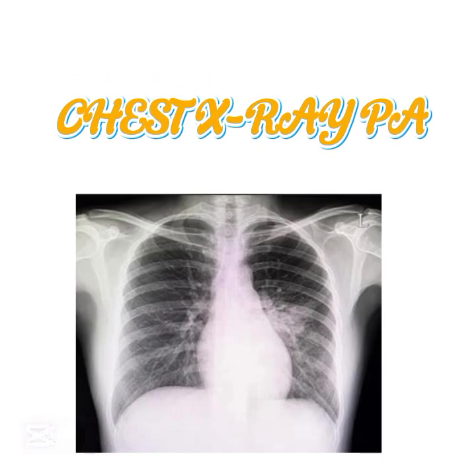So on today's episode, we're looking at chest X-ray PA technique. Now, what is the PA technique of the chest X-ray? It is an imaging of the chest area of the human body to evaluate the lungs, the heart, and the surrounding structures like the ribs. It is used to look at the pathologies of the lungs and the heart.